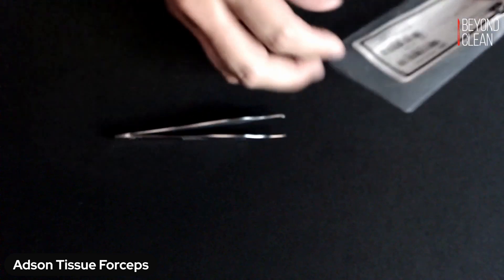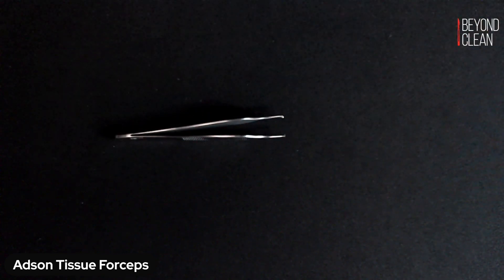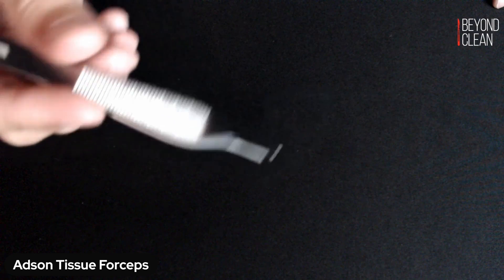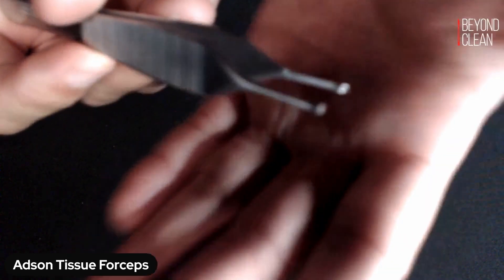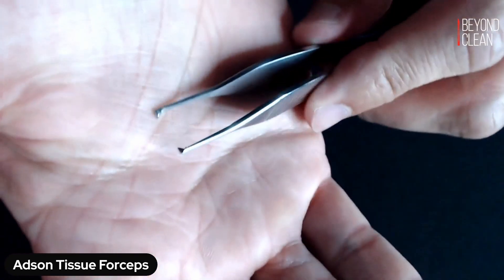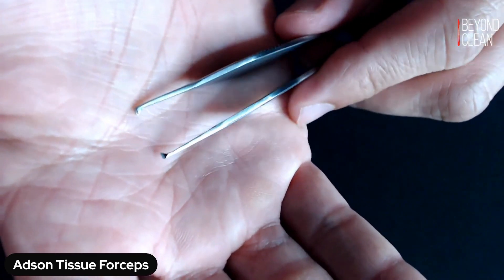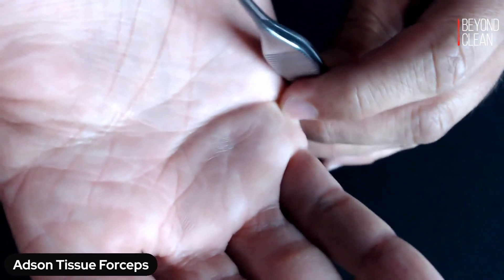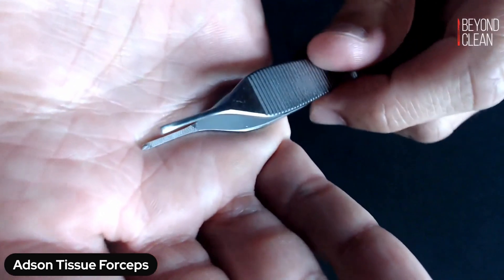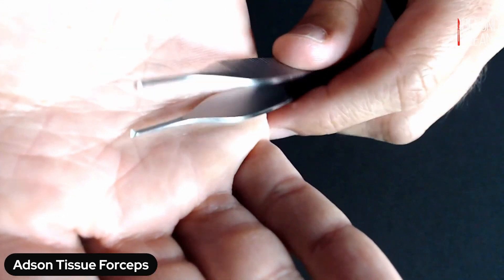All right. Anytime you see the word tissue in the forcep category, you're going to want to be looking for those teeth. And you can kind of see they're very small teeth here at the end. This is a 2-1 teeth combo on your Adson forceps.